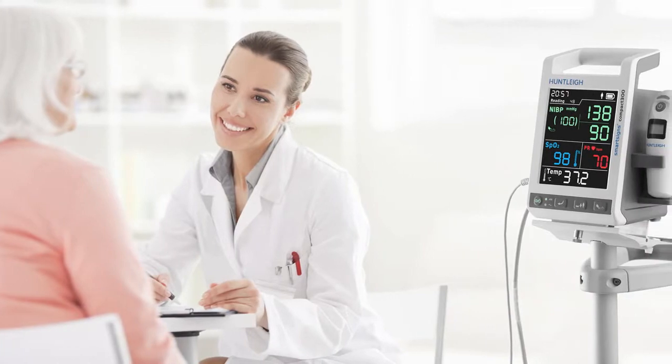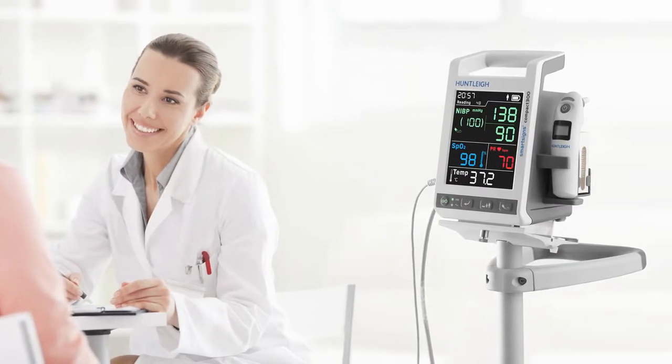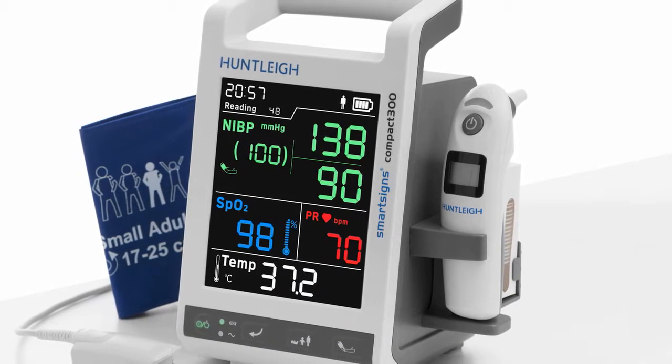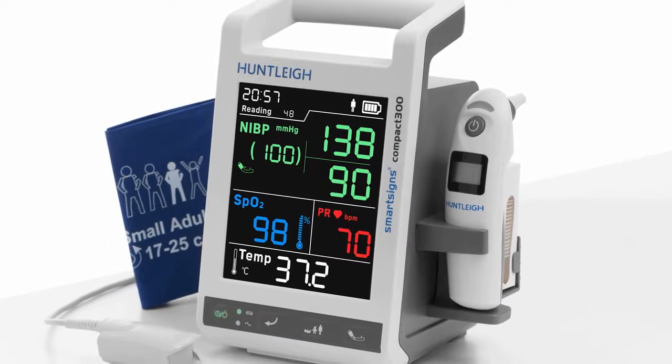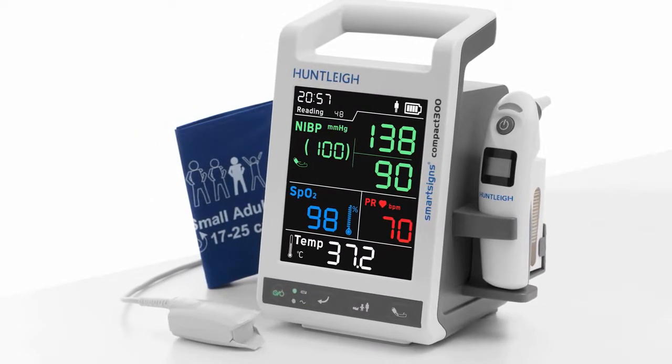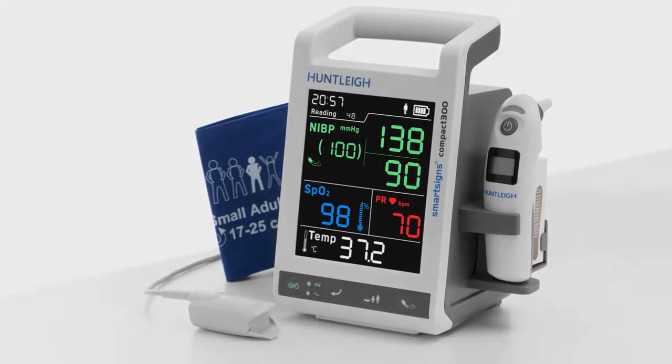Each SmartSign SpotCheck monitor is supplied with a standard starter pack of accessories. Each pack is specific to the particular model. In this example we are using the Nellcor pulse oximetry version with a temperature option, model number SC300NT.